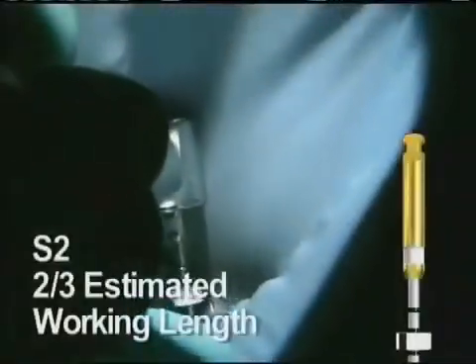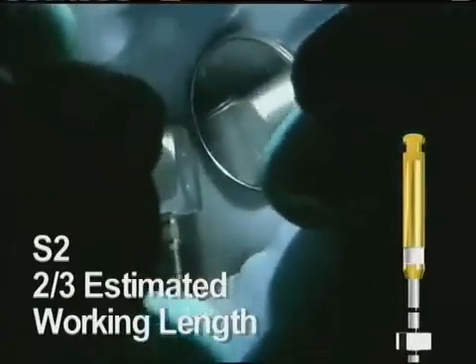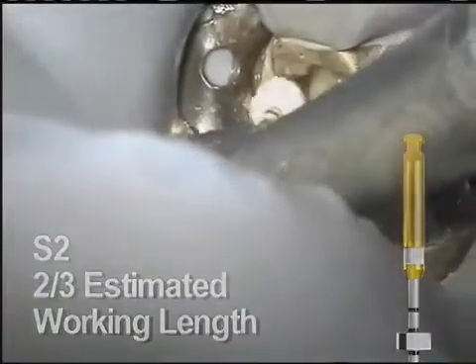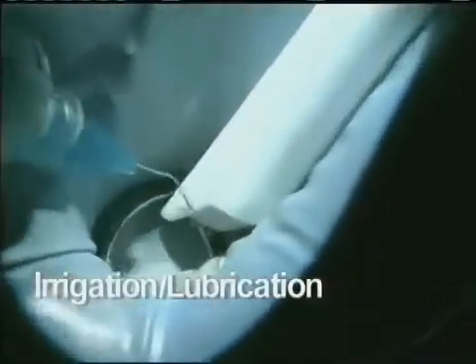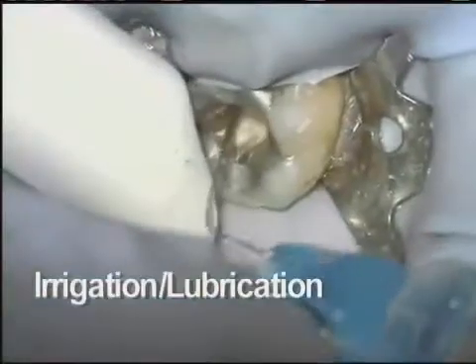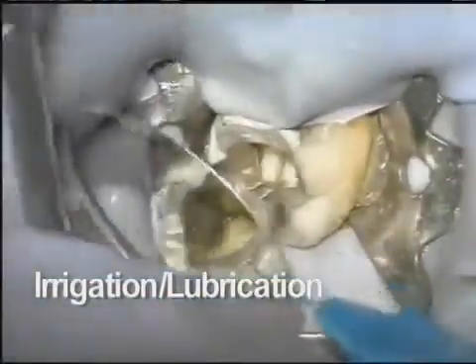Shaping file 2 is next. It goes to the same depth as the S1. While it may not always be necessary, the S2 can also be used in a brushing fashion. Here, it goes easily to the predetermined limit. Throughout the procedure, use of sodium hypochlorite and a lubricant such as ProLube is strongly suggested. These help by digesting tissue and clearing the way for files as they work their way down the canal space.